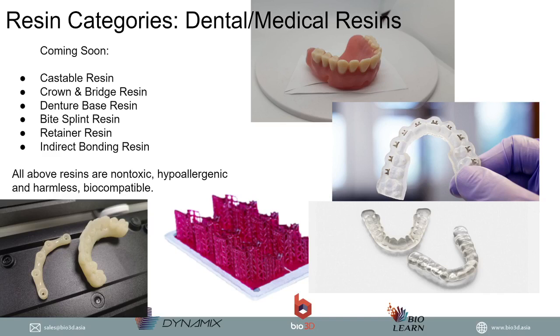If you have somebody who is a bruxer, you know very well that enamel, while it may be extremely strong, still chips. And so this is plastic, but it also has a very high abrasion resistance. So it will resist abrading as much as possible, but because it's a 3D printed resin, you can definitely just 3D print another copy if your patient requires, for example.